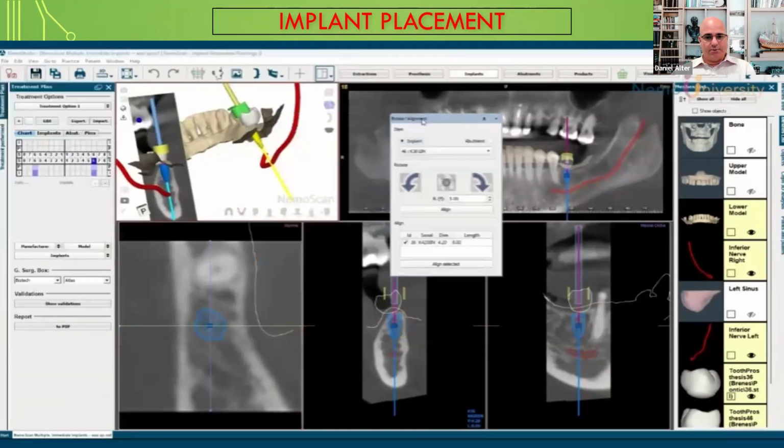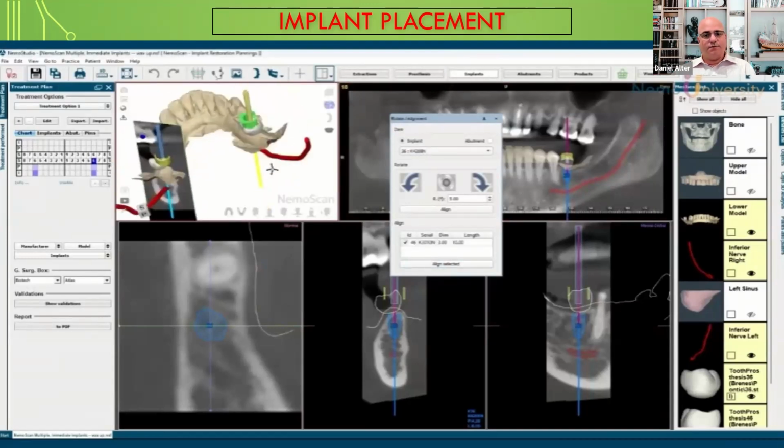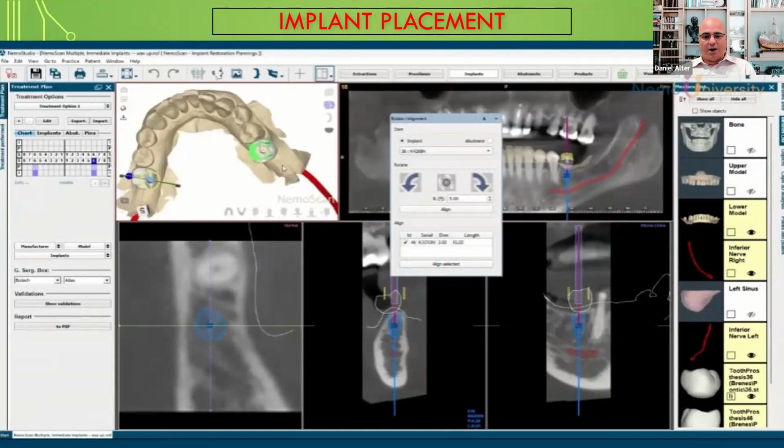Nowadays with surgical guides, I mean, the success, I should say, of implantology has risen significantly from perhaps 15 years ago, or maybe even 20 at this point, when it was hovering about 80%. Now, assuming all the health criteria are met, we're reaching a success rate of 98%. And I really attribute it to the level of technology, the surgical guides, the acumen, the success that we as a laboratory community and a clinical community can collaborate to make it for the patient the best possible outcome that they can have.